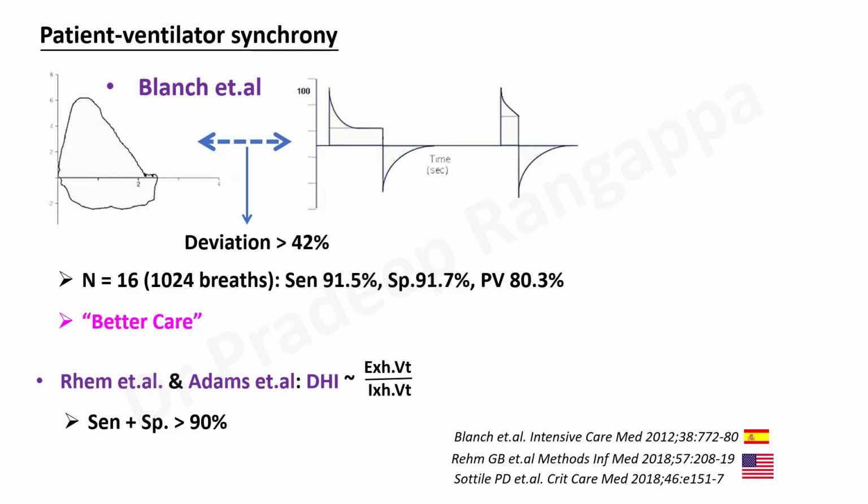So, which means to say, to physically assess the dyssynchronies that may be prevailing in our ICU patients within different timelines is humanly not possible. So we need to understand the basics. The basic understanding is we should not overventilate or underventilate. We should not provide unnecessarily higher tidal volumes, and we should not provide unnecessarily higher pressure support. We should not unnecessarily provide higher PEEP. On the same note, we should not underventilate also, and we should not provide suboptimal PEEP, and we should not reduce our pressure supports to a point that ventilation is becoming inadequate.